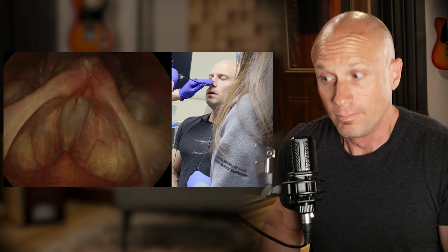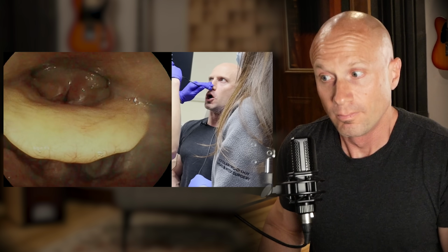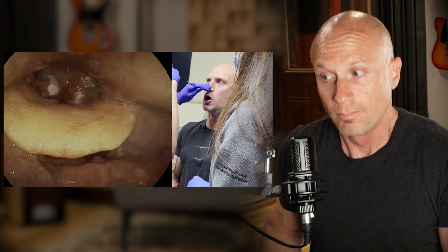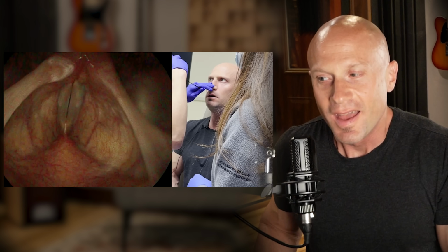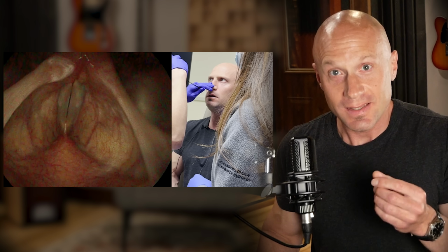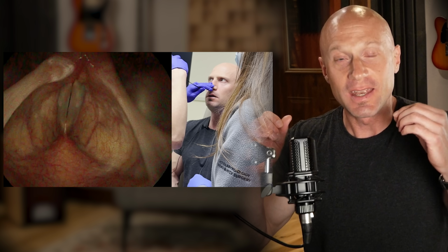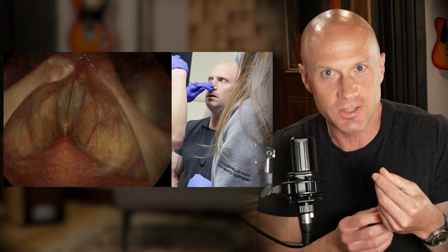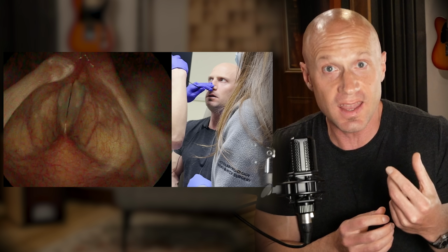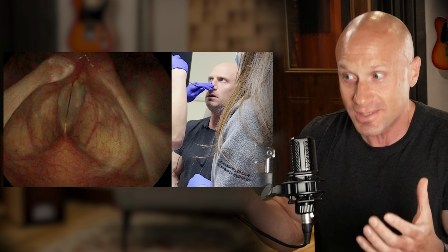Into a long, thin, stretched head voice note again. And then as I go back out, you can see and hear when the arytenoids sort of back off. Then you have the false cords flapping next to each other with primary cord engagement, and you get that buzzer sound. I love that you can see it, and it looks so different than some of the other things that you're seeing.